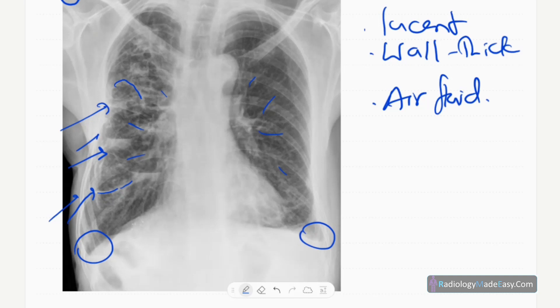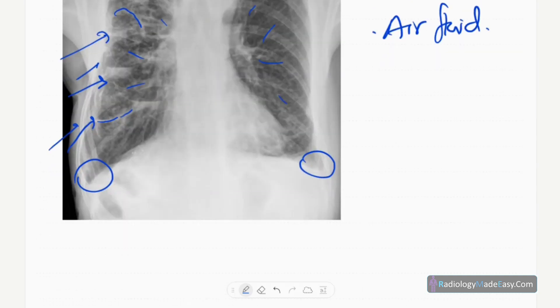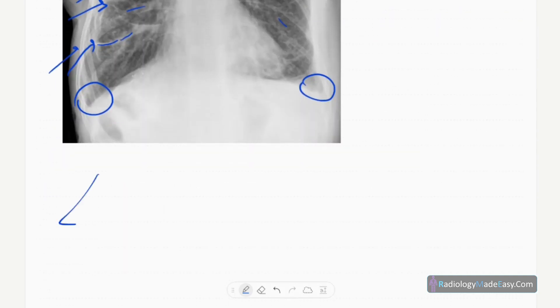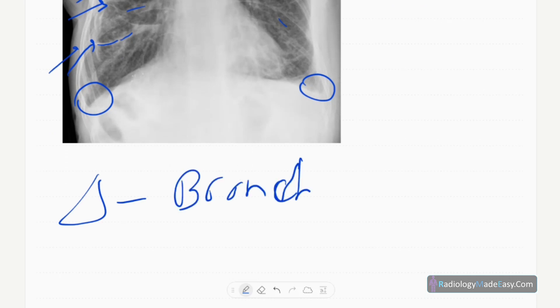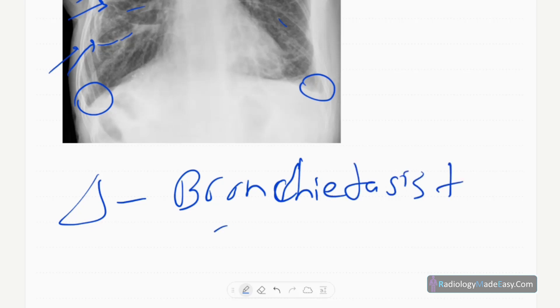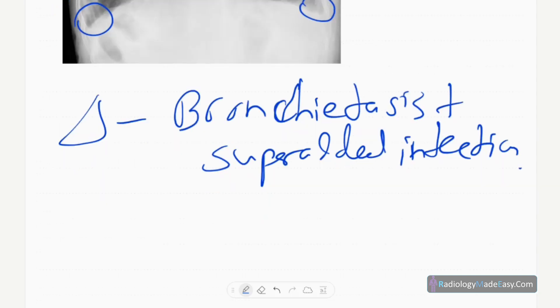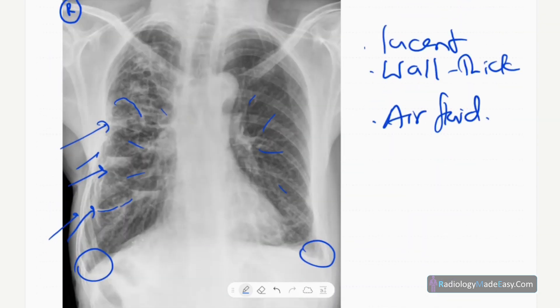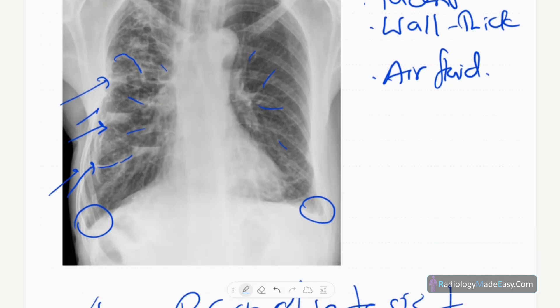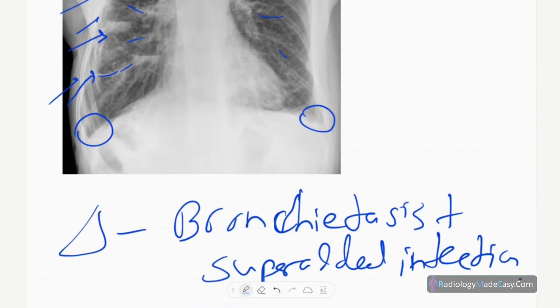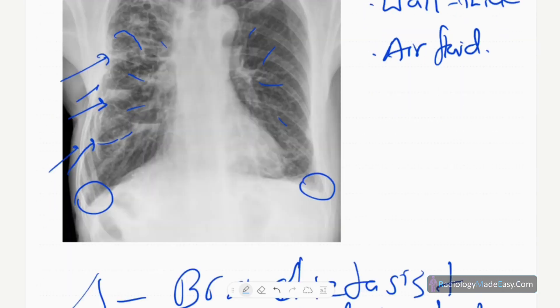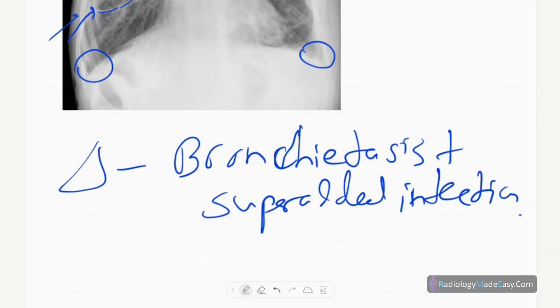The diagnosis of this case is bronchiectasis with superadded infection. This is the diagnosis — superadded infection is indicated because there are air-fluid levels and wall thickening of the dilated bronchi. These ring shadows are dilated bronchi, and this pattern is called cystic bronchiectasis.